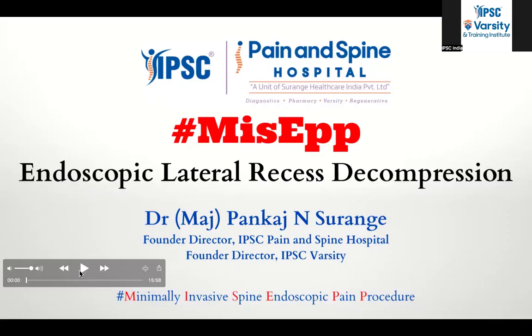That is again very important because the traditional method of doing endoscopy is not applicable over here. So we have to think out of the box to identify this lateral recess and to decompress it. So this is what we are going to do. MisEpp is the minimally invasive spine endoscopy pain procedure. I'm going to show you a prototype example of this lateral recess decompression.